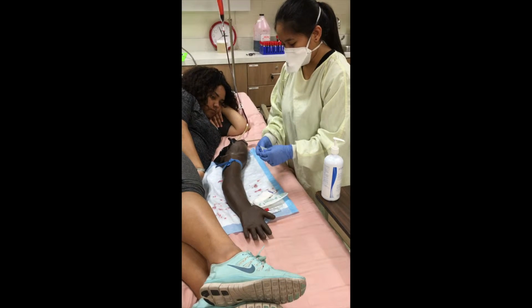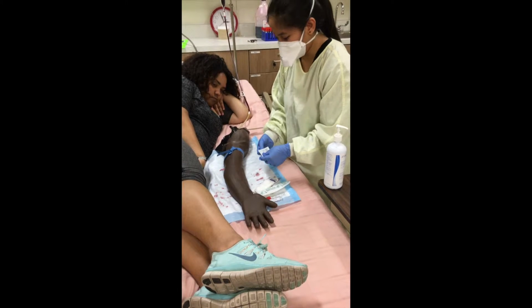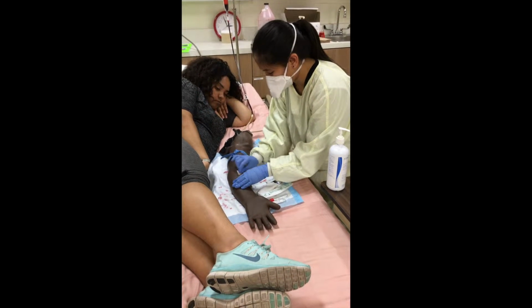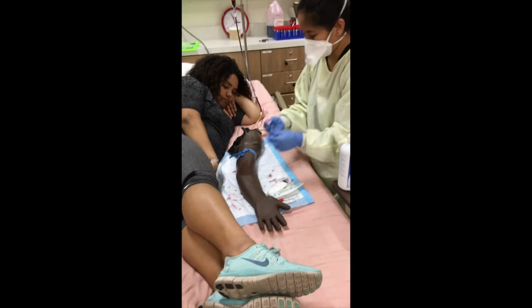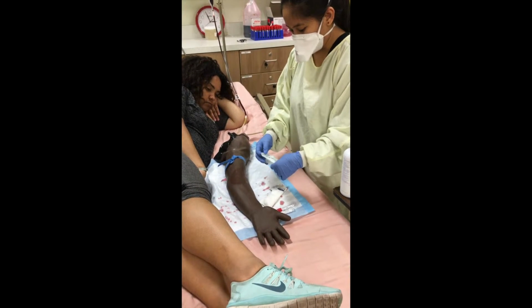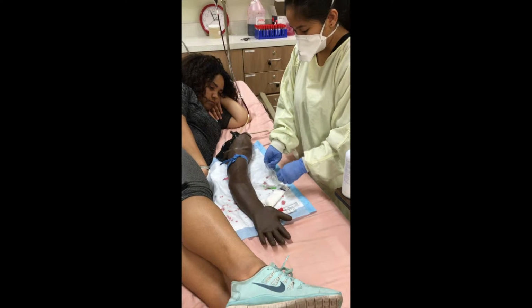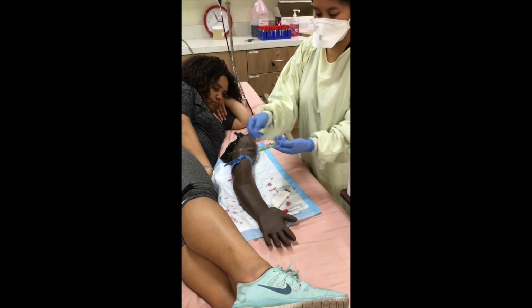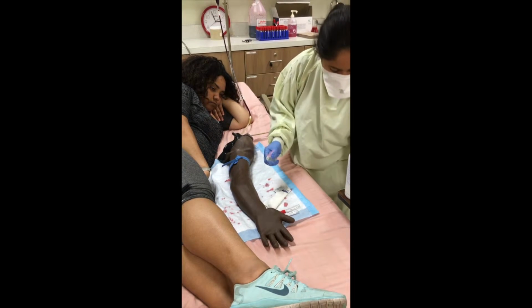So just use an alcohol swab to clean the area of where we'll be injecting the needle. We start in small circular motions and then spreading out. Then we can throw it in our regular trash over here. Then we get our Vacutainer ready. And we just pull this back. This can go into our regular trash.